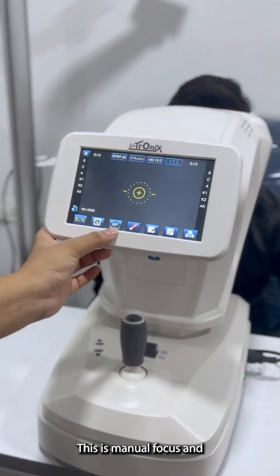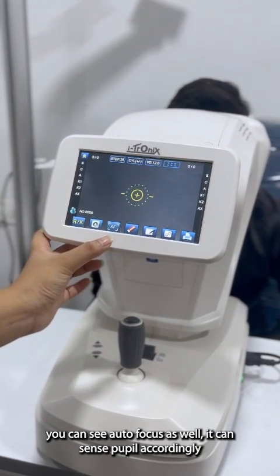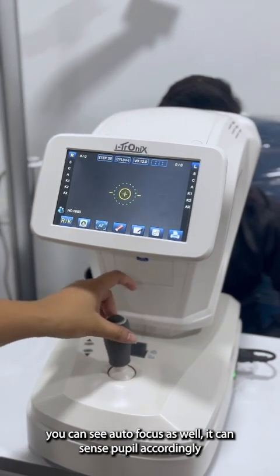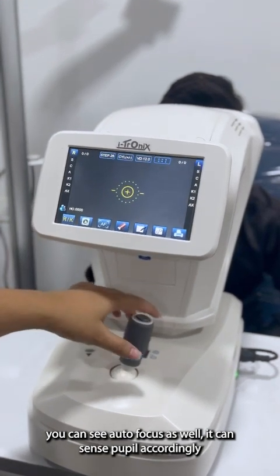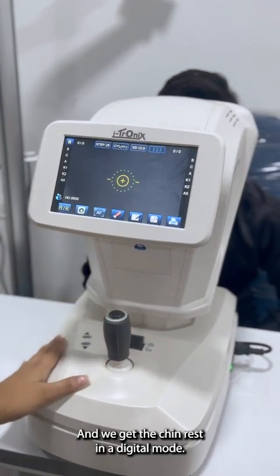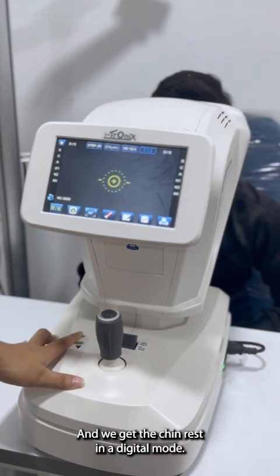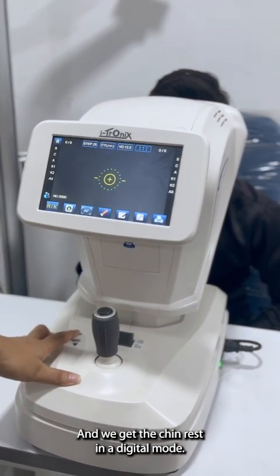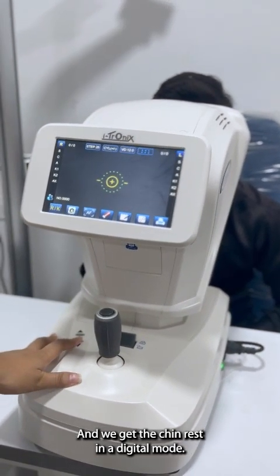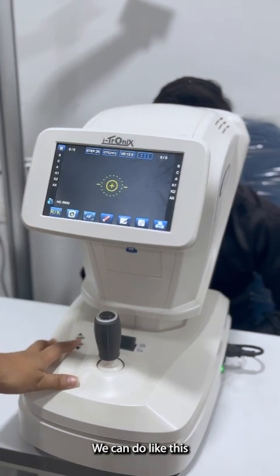This is manual focus and you can select autofocus as well. It adjusts the pupil accordingly. And we get our chin rest in digital mode, not in manual mode.